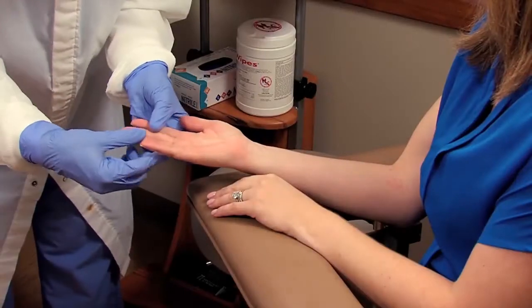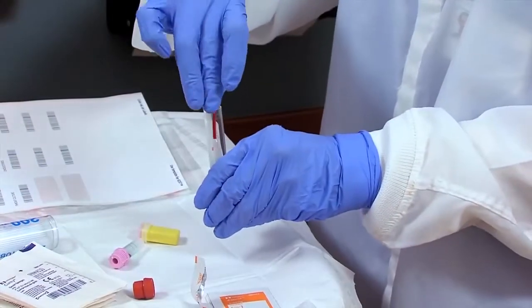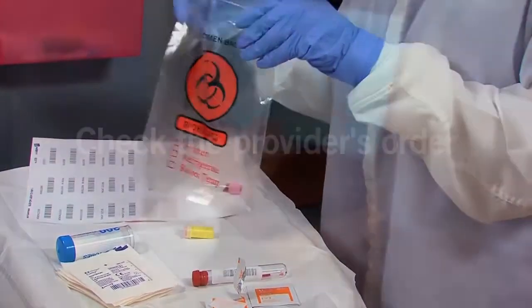A capillary puncture, also called a dermal puncture or finger stick, is an efficient means of collecting a blood specimen when only a small amount of blood is needed or when the patient's condition makes venopuncture difficult.